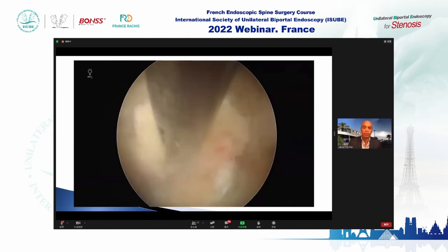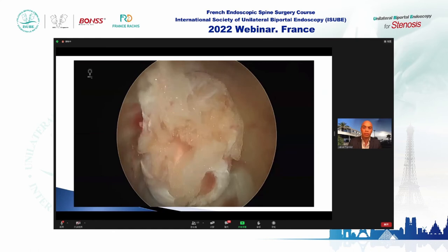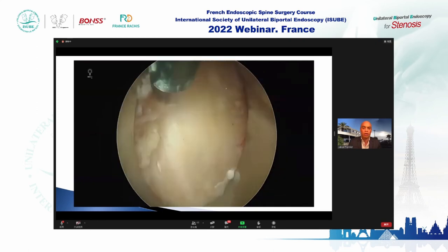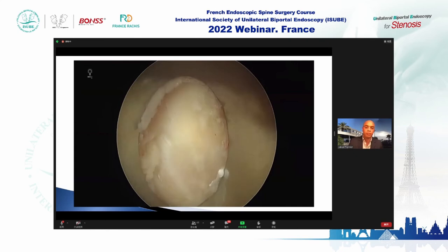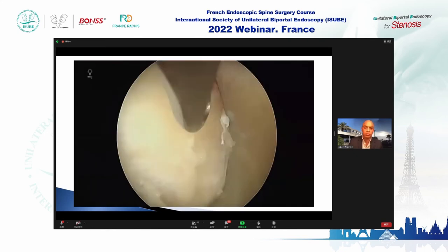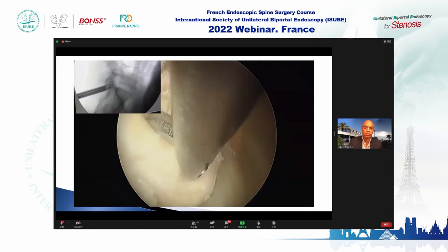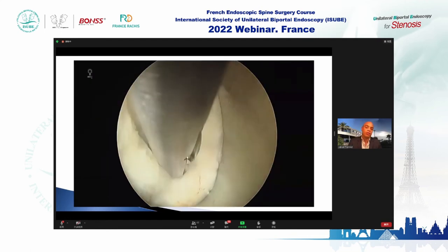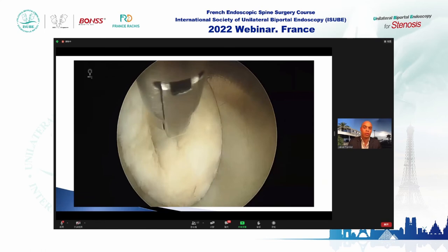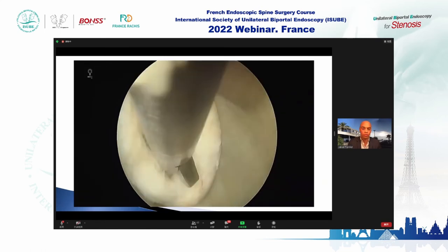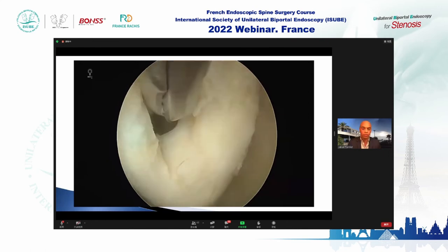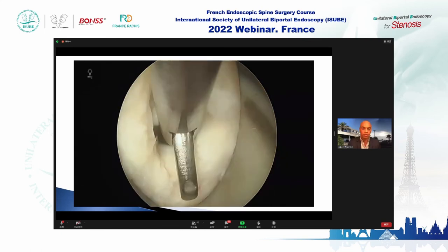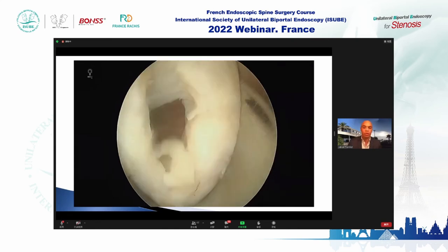Now you have muscles and fat tissues outside the canal. When you clean it, you identify the flavum ligament. You enter with scissors and make the first hole in the flavum ligament, always from the medial side to the lateral direction, toward the facet joint. Now you have the passing root visible. You do coagulation in the recess and confirm that just below the root is the disc.